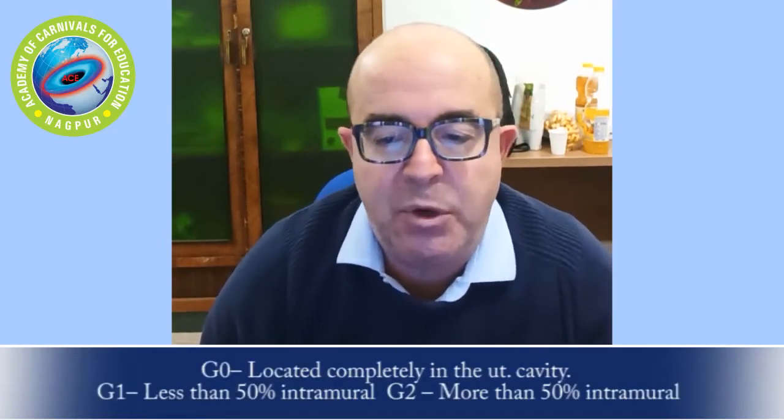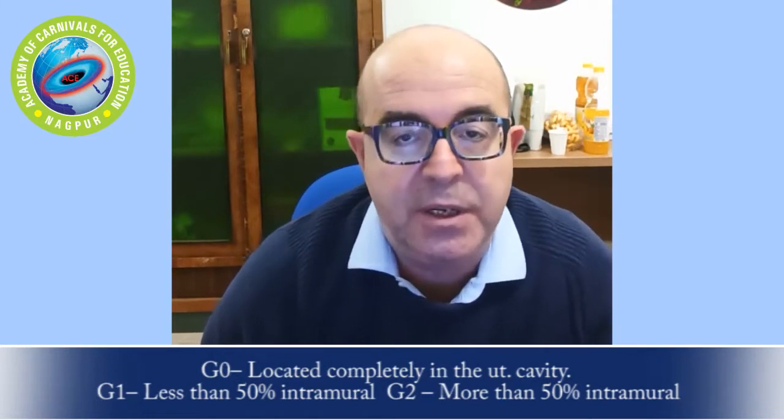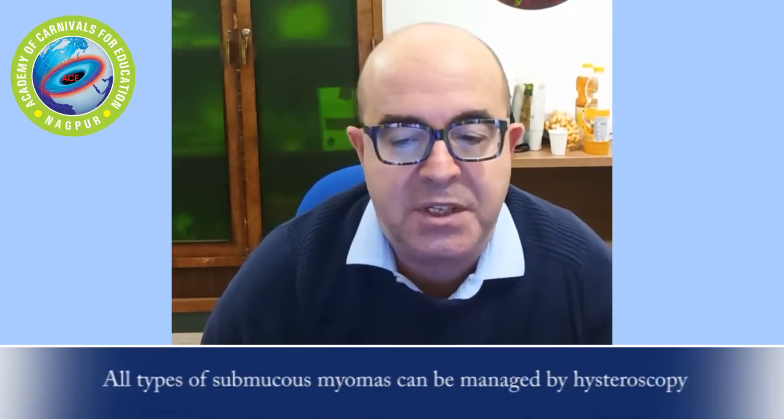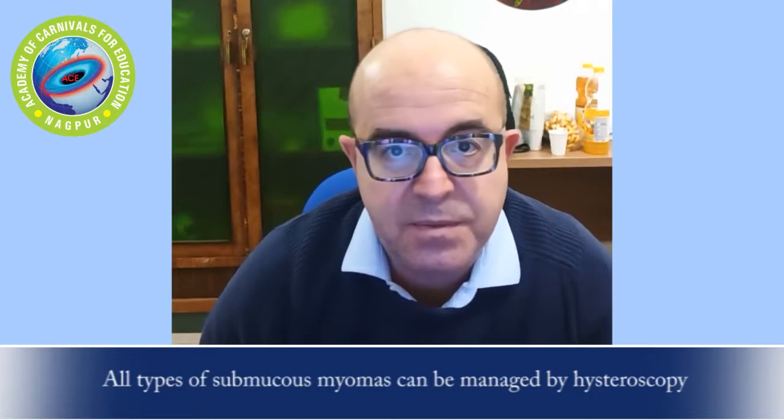Endoscopic approach by hysteroscopy or laparoscopy are the preferred methods for uterine fibroid removal. Submucous myoma represent one of the main indications for operative hysteroscopy. Generally, in the presence of submucosal fibroids, hysteroscopic resection is a simple, safe and effective treatment. Based on FIGO classification, submucosal fibroids as G0, G1 and G2 can be enucleated by hysteroscopy. Some fibroids can be enucleated in office setting, while others should be removed in the operating rooms in narcosis.